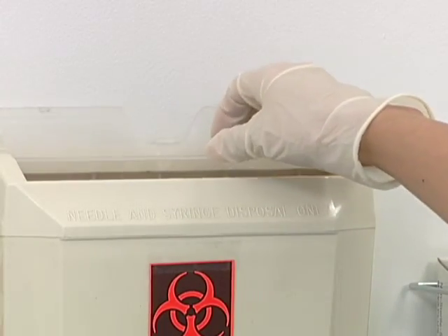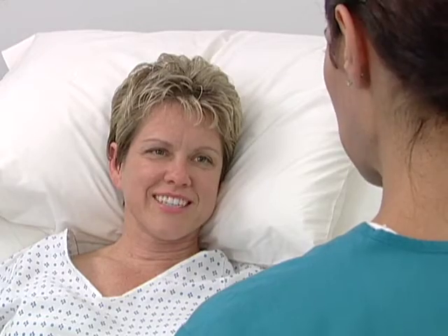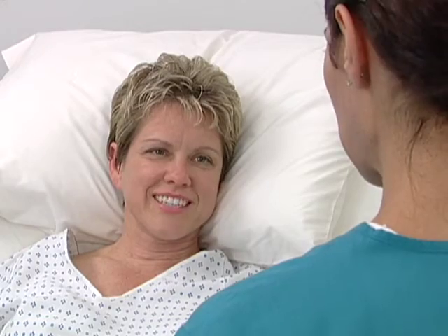Holding the flashback chamber stationary, disengage the hub from the introducer needle, advancing the catheter into the vein. Do not reintroduce the needle into the catheter at any time. Before withdrawing the introducer needle from the catheter, retract the needle.